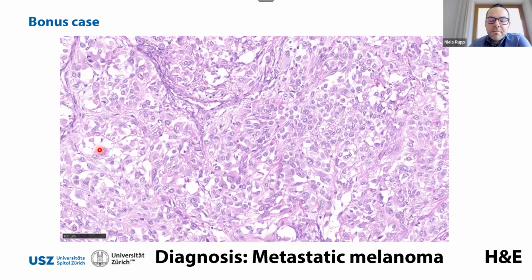So this was a metastatic melanoma, indeed mimicking and camouflaging here, a very difficult to type lesion, even with molecular testing. So at the end, the learning from this case was that with the BRAF mutation in a salivary gland specimen, you have to be very careful because in a primary salivary gland neoplasm, it is very rare.